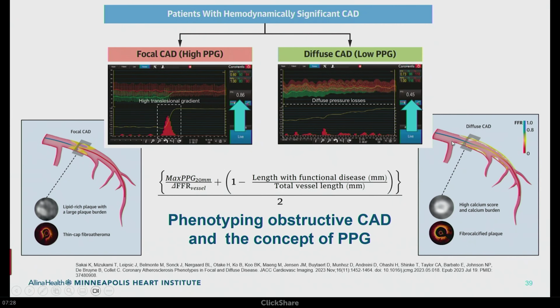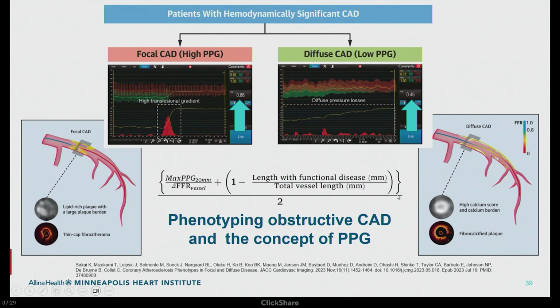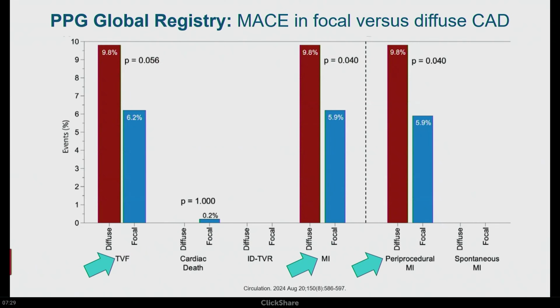This is the future of coronary disease, to improve phenotyping, whether that's with a number of tools. We talked about CT. Now this is how this is trying to be addressed in the cath lab with wires. And these two slides that I had, this one of angiographic co-registration and this one from PPG, they're trying to get at the same concept. How do we better understand not just a distal number, as if it were a pregnancy test of abnormal, but what type of coronary disease it is.